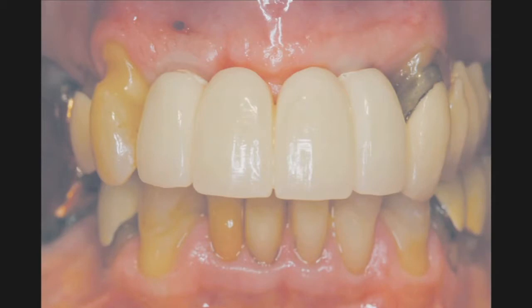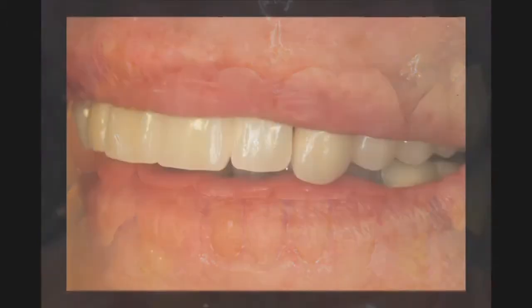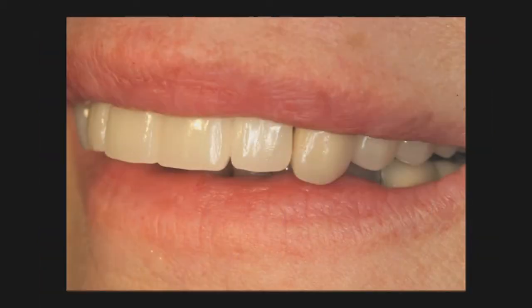A transitional bridge was seated immediately at implant placement. All excursive contacts were removed. In this case, the patient exhibited a class 2 relationship with no anterior occlusion anyways. And you can see that the laboratory was able to fabricate something that was very decent as a transitional or temporary restoration. And she was absolutely thrilled that she was able to eliminate the flipper that she had been wearing for 8 months that had diminished her quality of life dramatically.